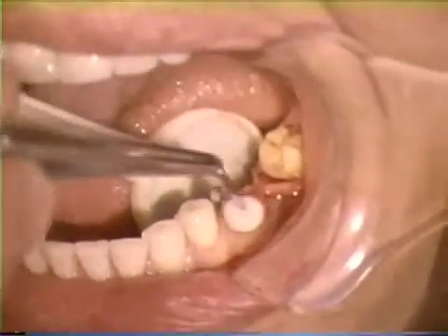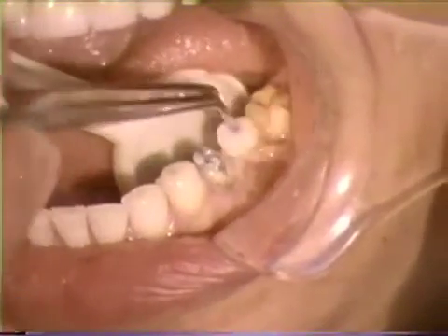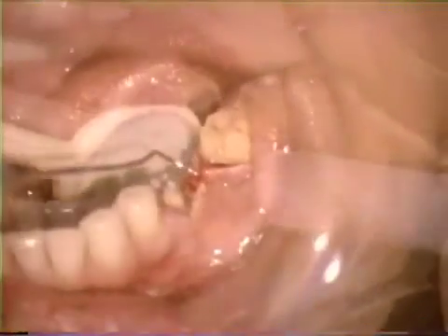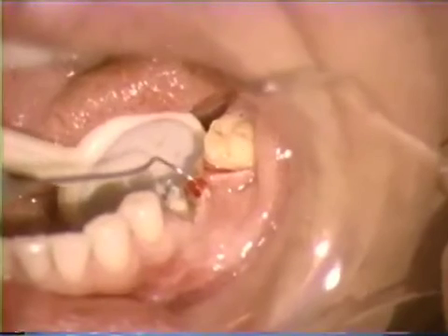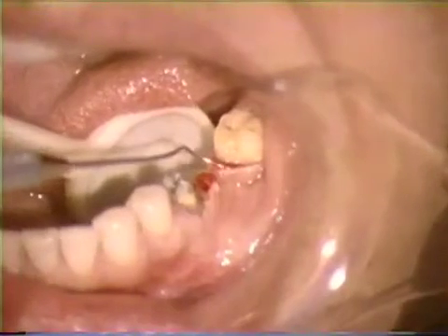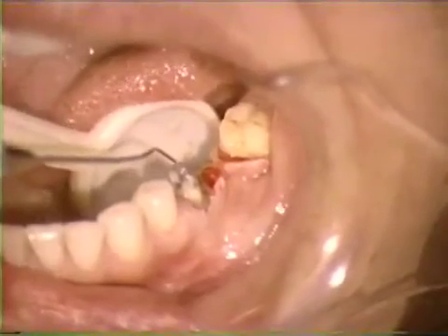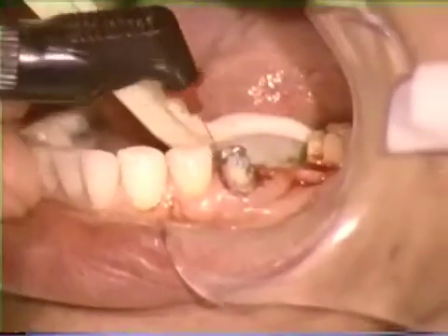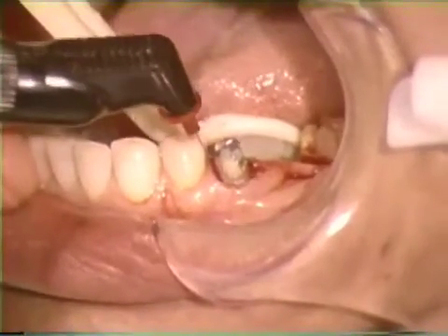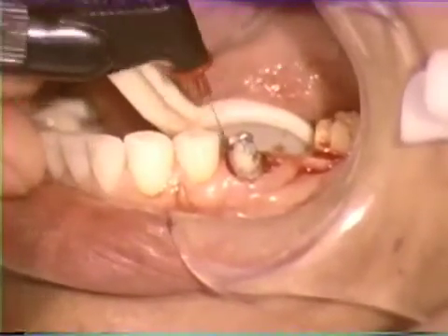When surgical procedures are nearly complete, the operated area can be rinsed using 3% hydrogen peroxide followed by water. With the area now more visible, previous surgical cuts can be refined by removing any remaining tissue tags and remnants. As will be noticed, the mesiodistal pontic space has been increased. The straight, unshielded wire electrode is helpful to refine previous cuts, improving visibility and access needed for placing finish lines and impression material.